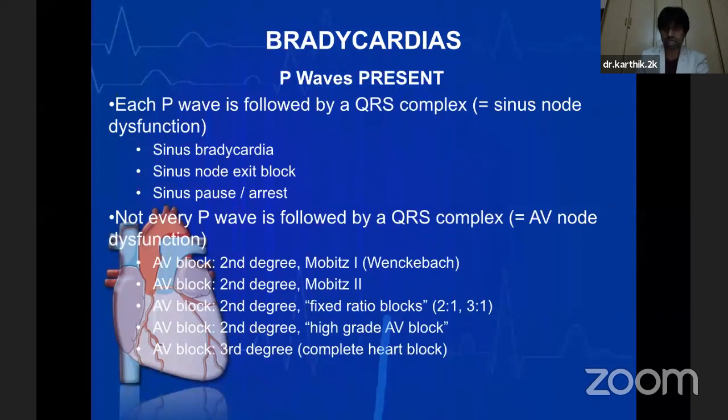However, if you question which is more lethal, you have to see that the Mobitz type 2 indicates that these patients are at higher risk of going for a complete heart block, who may require further evaluation.